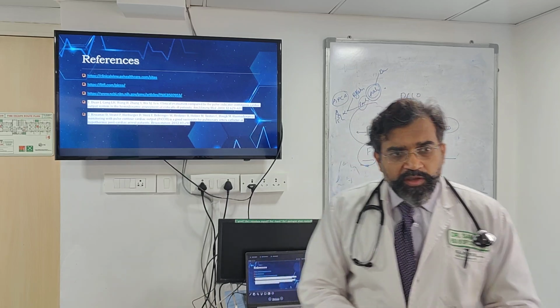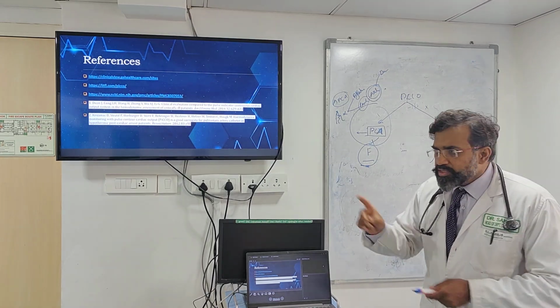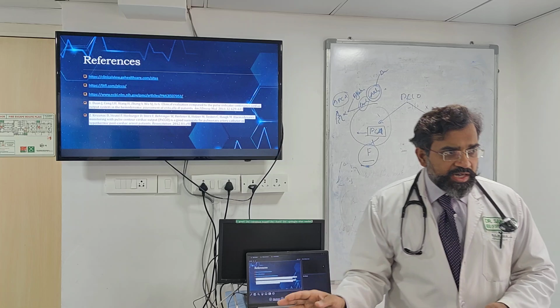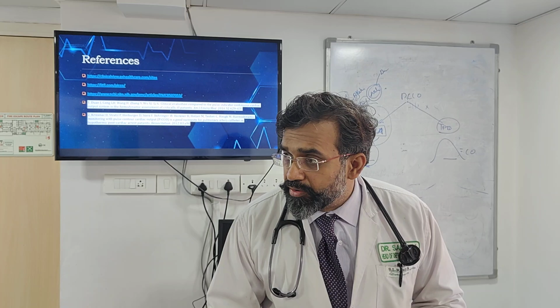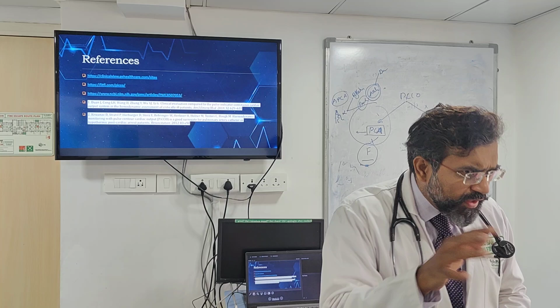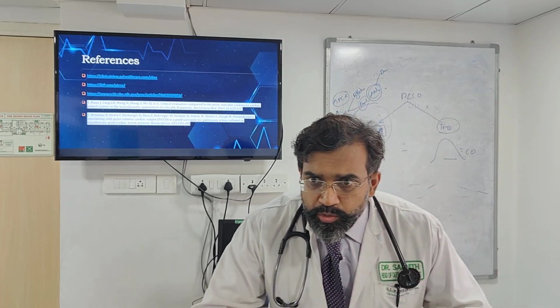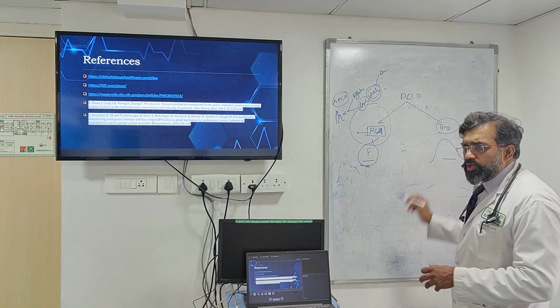Right? What this is doing? It is actually going to do a thermodilution and then tell you, okay, with this thermodilution curve, this is my cardiac output, which is the most accurate method to say that this is the cardiac output at the given moment. PAC, the pulmonary artery catheter, which is the Swan-Ganz catheter, is the gold standard. This is very close to the gold standard. So at this moment, since PAC is not something we are using regularly, this becomes our gold standard. So the closest to the right cardiac output monitor is transpulmonary thermodilution.